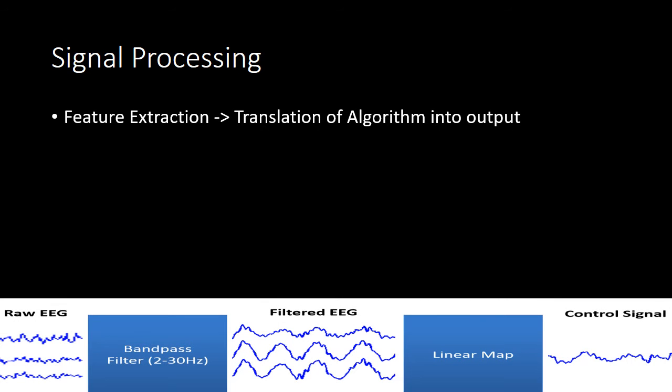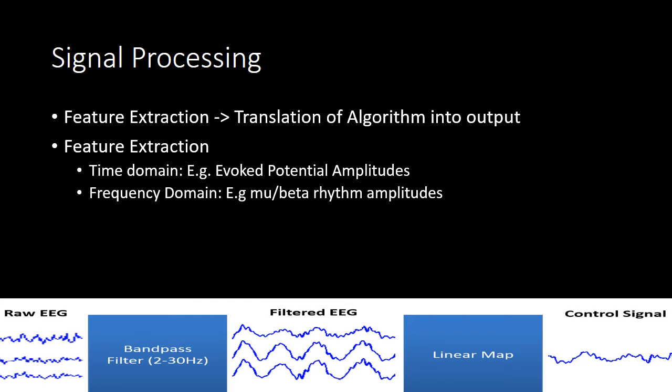Once we have the digital signal, it could be used for feature extraction and translating the features into output command to drive a device. The digital signals can go through a variety of feature extraction procedures like spatial filtering and voltage amplitude measurements and spectral analysis or single neuron separation. This analysis extracts the signal features that encode the user's messages or commands.